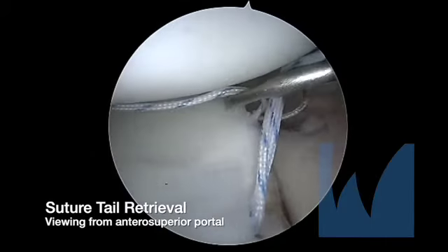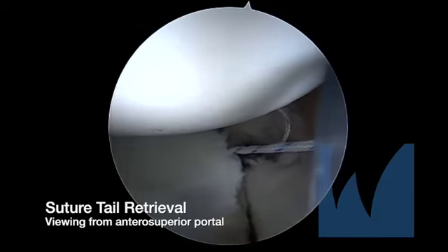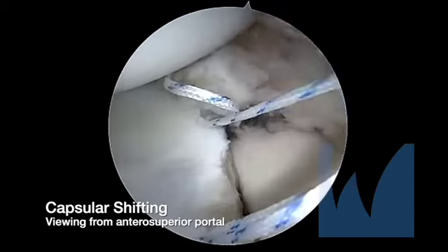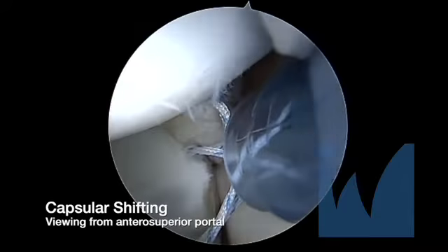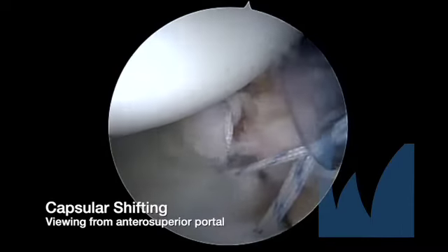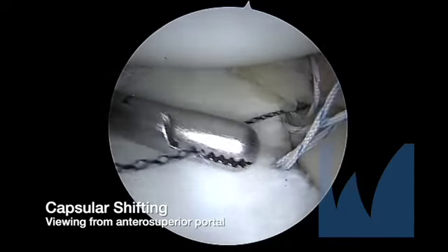The three most superior suture tails of the anchors at the margin of the graft are retrieved through the antero-inferior portal. Tension is applied to the traction suture to shift the capsular tissue superiorly. A curved suture passer is threaded inferiorly and passed below the level of the most inferior anchor on the glenoid, retrieved through the posterior portal, and used to thread the most inferior suture tail of the inferior anchor through the antero-inferior portal.